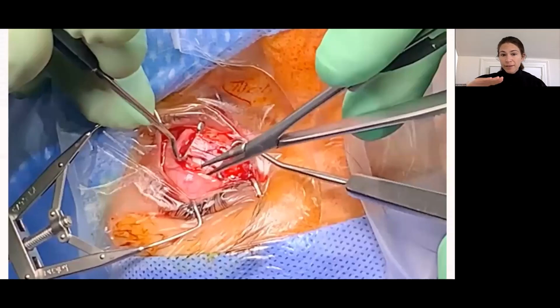Because the locking bite is underneath the muscle, it will not strangle or put pressure on the arteries that are on the surface. And because you're going back and forth through the muscle and then locking it from the center outwards, you can ensure that all of the muscle fibers will be incorporated in your plication without a central sag.